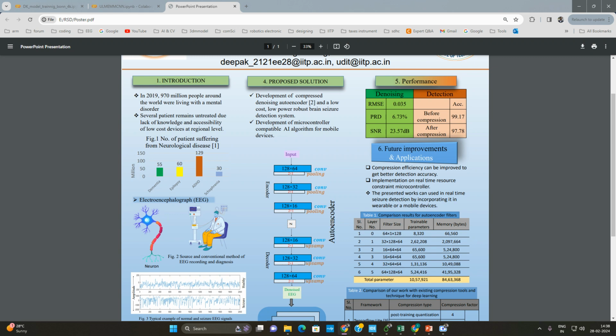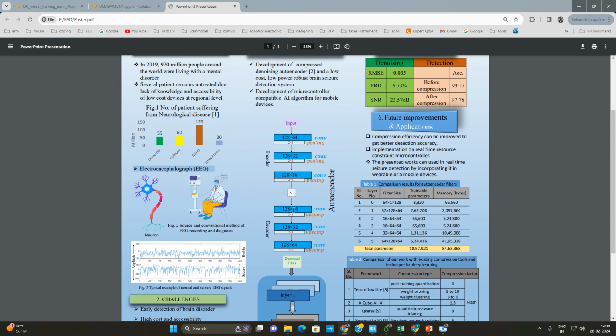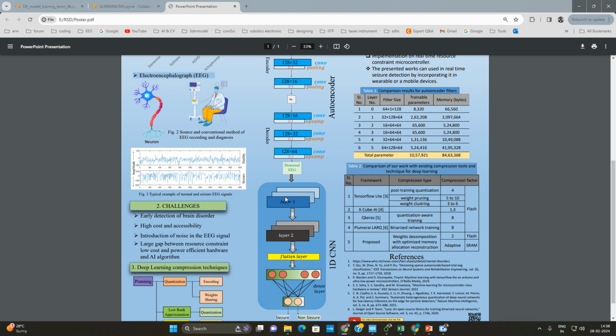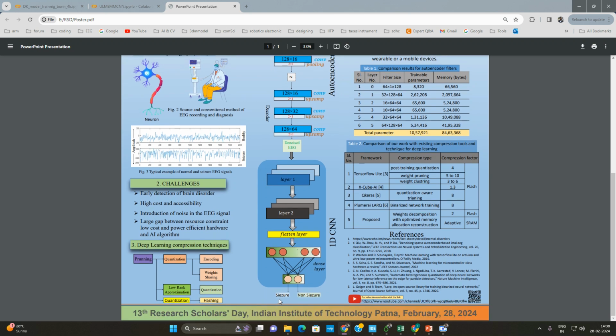This is the first stage, where we take the signals directly from the device and perform the denoising activity. The signal may get contaminated with various kinds of noise like eye blink, muscle artifacts, ocular artifacts, power line noise, etc. This stage, based on the autoencoder, removes the unnecessary noise. After this pre-processing stage, the signal is denoised and we feed it to a normal two-layer CNN model that is trained with some seizure datasets to give the output result as seizure or non-seizure.